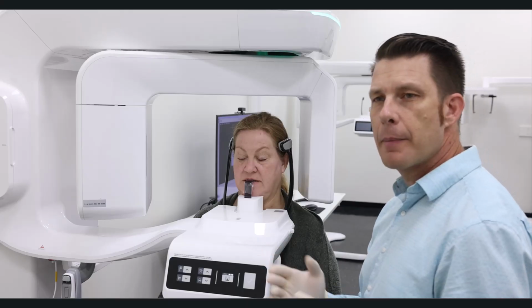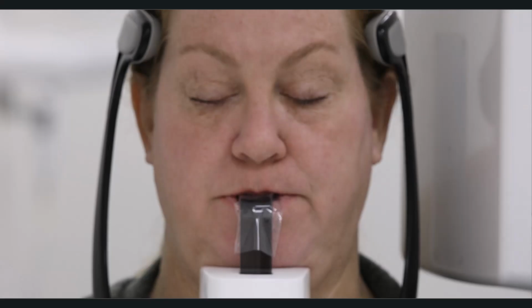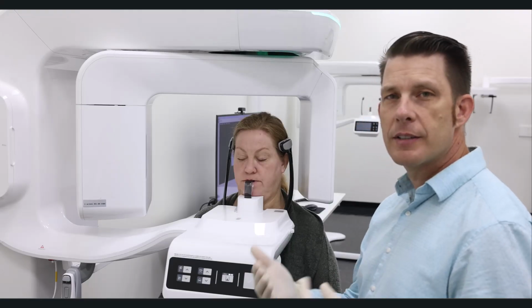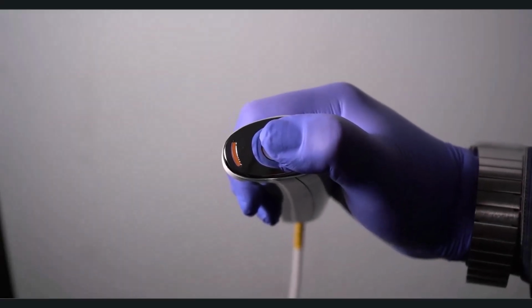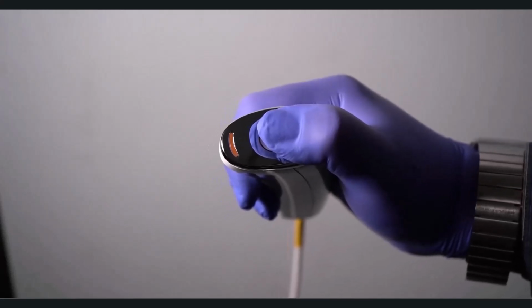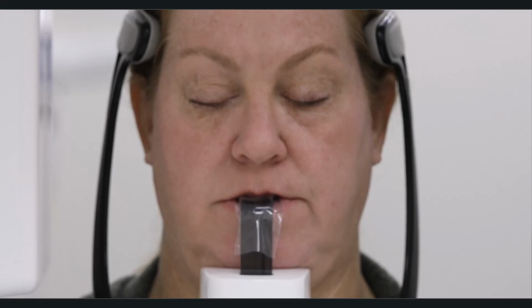The other thing with panoramic capture is I want to have the patient close their lips around the bite stick, go ahead and swallow, and keep the tongue flat to the roof of the mouth. Hold that position. We're going to go ahead and step out of the room and take our image. Hold the button on the acquisition trigger switch, which will turn yellow when exposing. Hold the button until the image acquisition is fully complete. Image capturing is complete. Please wait a moment.